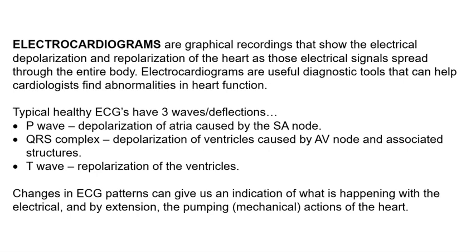Electrocardiograms are graphical recordings that show the electrical depolarization and repolarization of the heart as those electrical signals spread through the entire body. Electrocardiograms are useful diagnostic tools because they can help cardiologists find abnormalities in heart function. Typical healthy electrocardiograms, or ECGs, have three waves or three deflections.